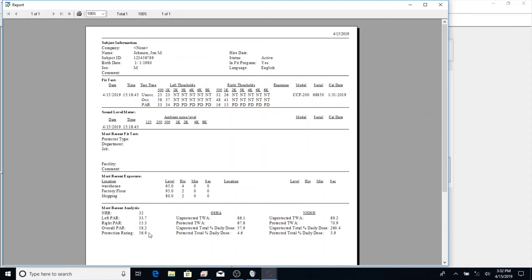And then if we go all the way to the bottom, we can see the overall PAR. So that's basically the average of the left and the right PAR. And the protection rating, this is a percentage. 56% of the protection that these are rated for, he's getting.